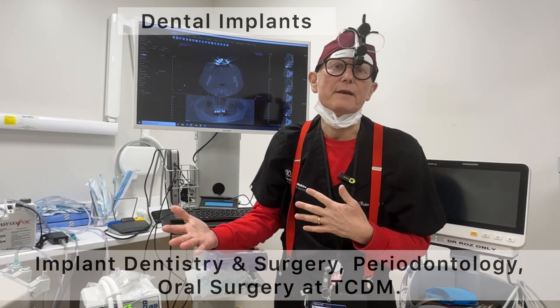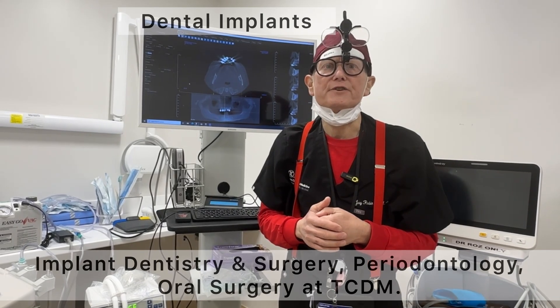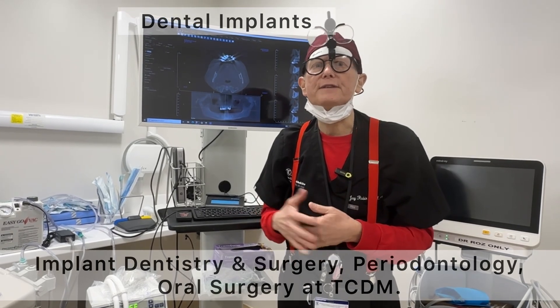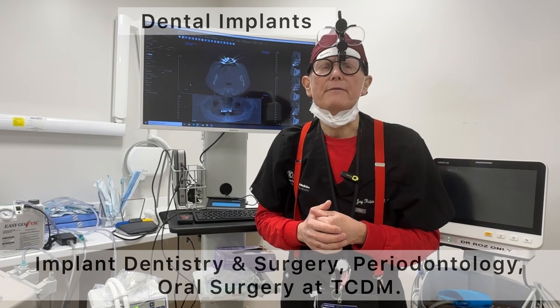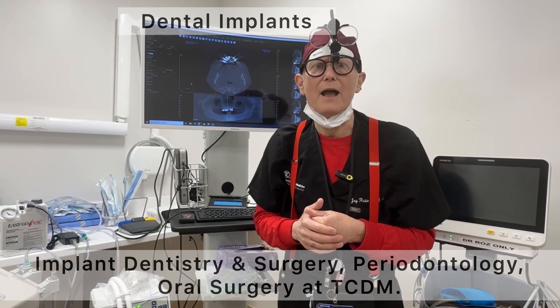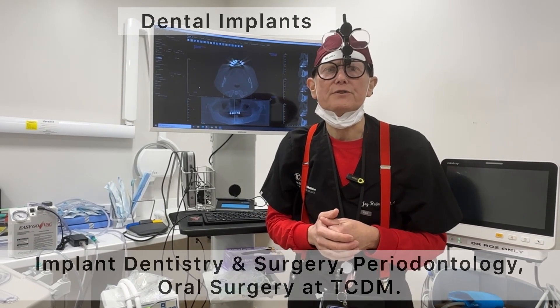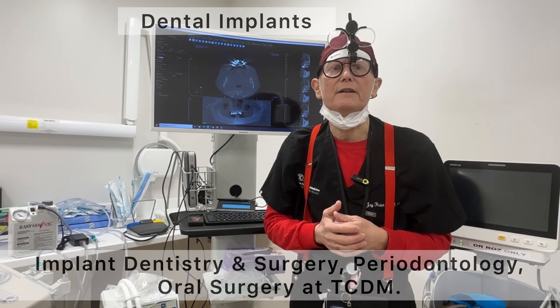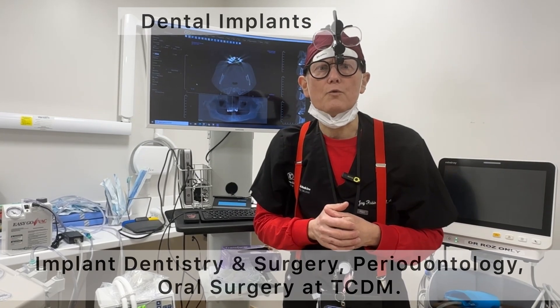What we've done here at TCDM, which is very unique, is we've designed the combination of digital dentistry, merging that with our surgical endeavor. We use CAT scans to create what's called DICOM data, and then from an intraoral digital scan of the patient's mouth, we've created what's called an STL file, and we merge those two to create the digital workflow using computer technology to integrate those two to create our surgical workflow.